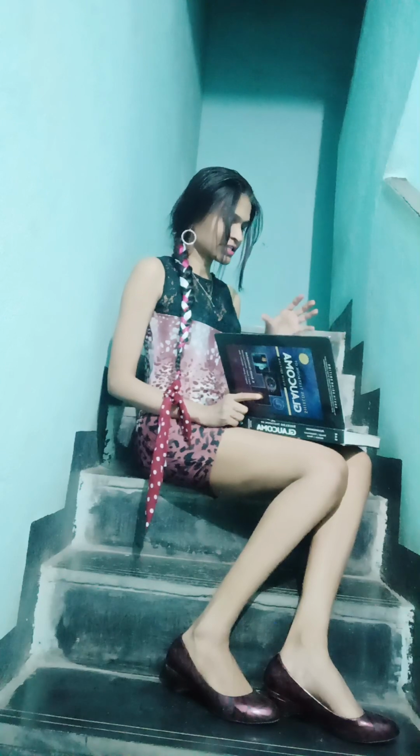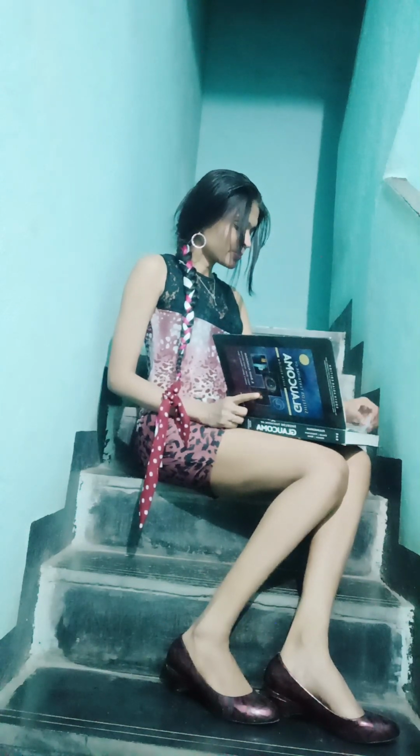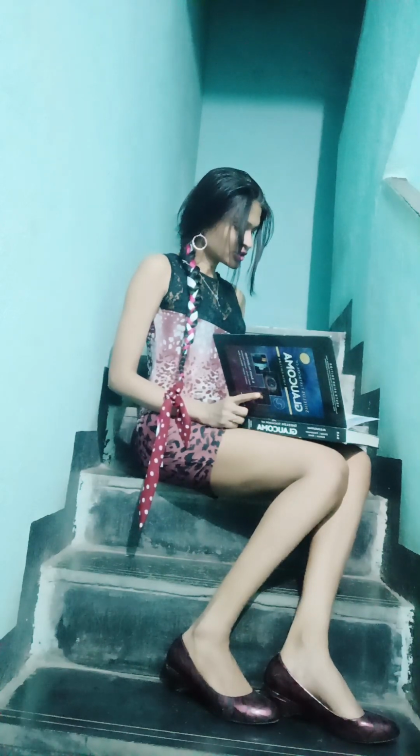Direct gonioscopy instruments. The Koeppe lens is the prototype diagnostic gonio lens and is available in different diameters and radii of posterior curvature. A gonioscope or handheld microscope provides 15 to 20 times magnification. The light source is usually a separate handheld unit, such as the Barkan focal illuminator, although it may be attached to the gonioscope. Technique: direct gonioscopy is performed with the patient in a supine position, preferably on a movable diagnostic table or chair, after applying a topical anesthetic.